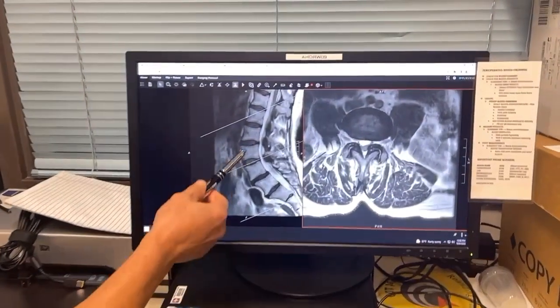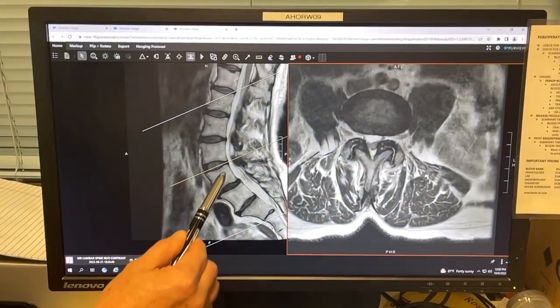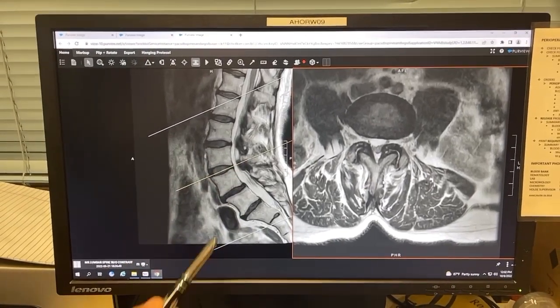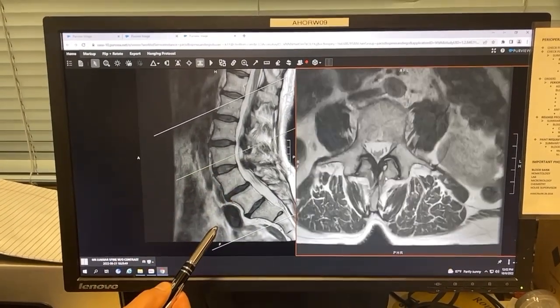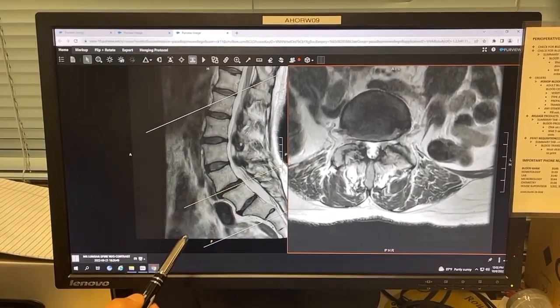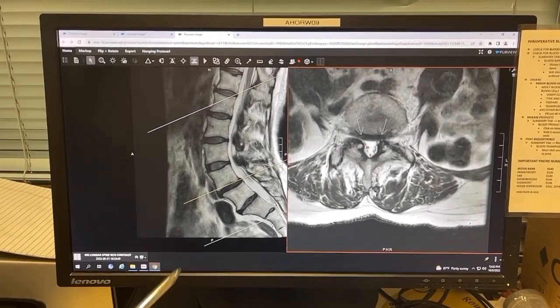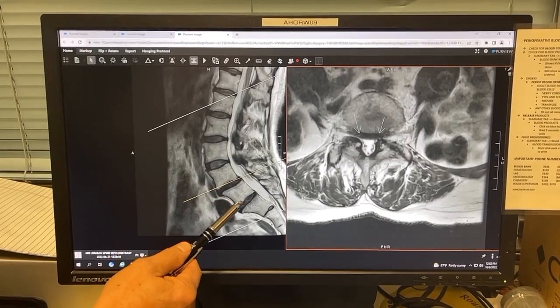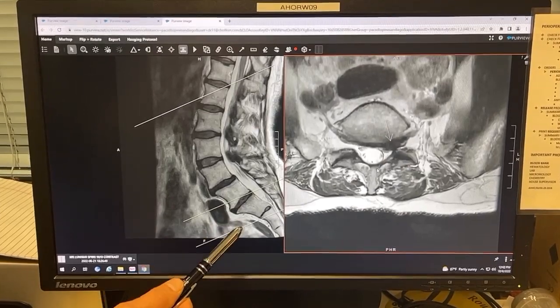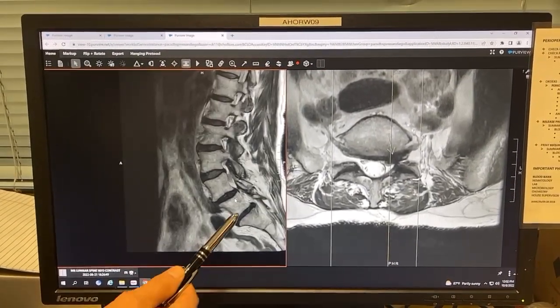Here's her MRI and this is the side view. These cigar-shaped things are the discs — that's the L3-4 disc, and that's what a normal disc should look like: big and plump and juicy. Now as you go down to L4-5 you'll notice that this doesn't look so good. There's a little slip — that's a spondylolisthesis. She's had that for a long time and she does not have that much back pain.